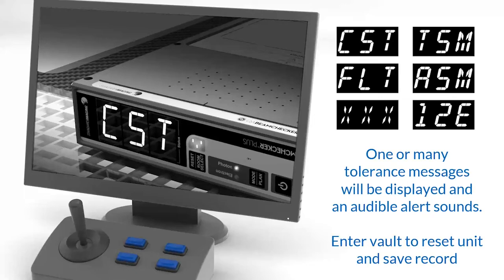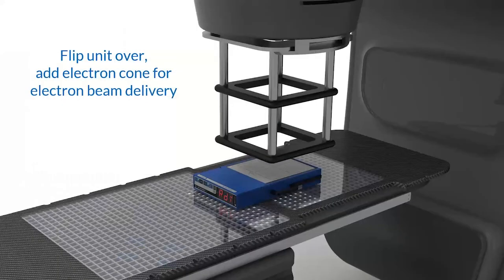So now I have completed my photons, and in order to test the electrons, I need to walk into the bunker anyway and put the electron cone on. And so you simply do that. You flip the device over, and you do a simple realignment to the light field and push the button that says electrons. And now your display, as you can see here, is on the other side because I've inverted the device and I've realigned it. I'm ready for electrons to go.